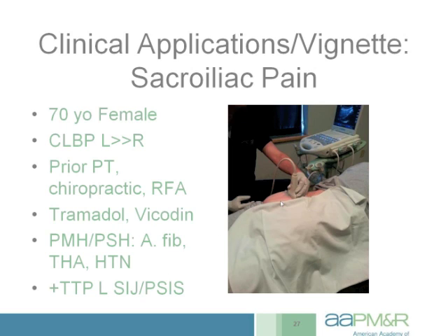You can see here, this is with a patient prone, the probe orientation essentially in an axial plane, sitting over the back of the sacroiliac area.